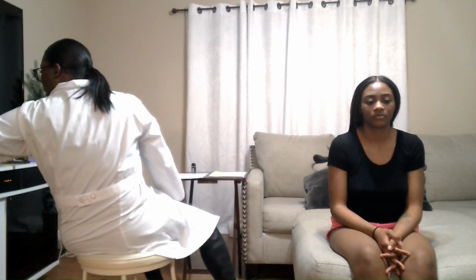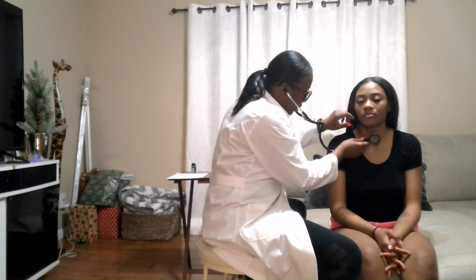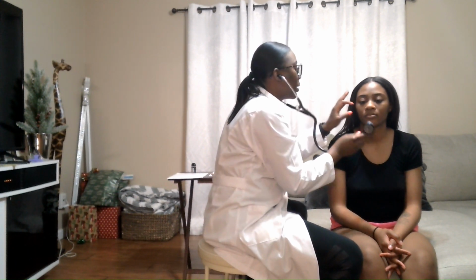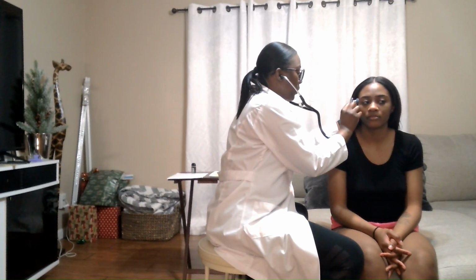And then I'm going to grab my stethoscope because I'm going to auscultate your thyroid. I'm listening for any bruit. When I do this, I'm going to use the bell of my stethoscope. I'm also going to listen to your temporal artery. I'm listening for any bruit. And then I'm going to listen over your eye. Close your eye for me. And I did not hear any bruit in either of those, in your temporal, your eye, or your thyroid.